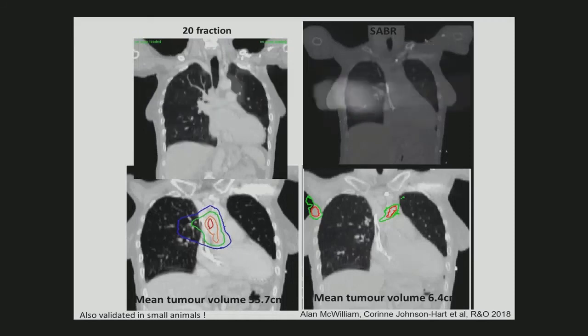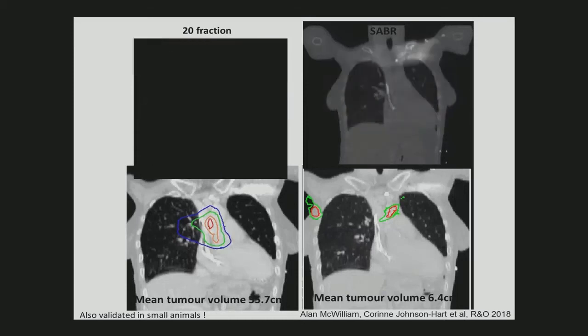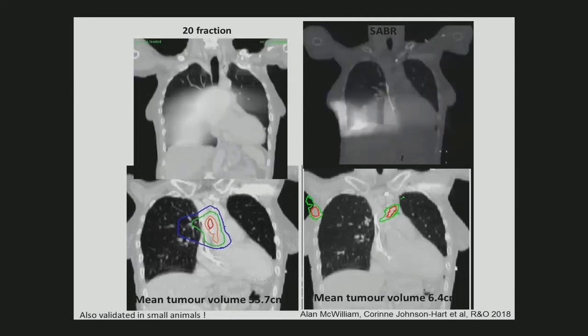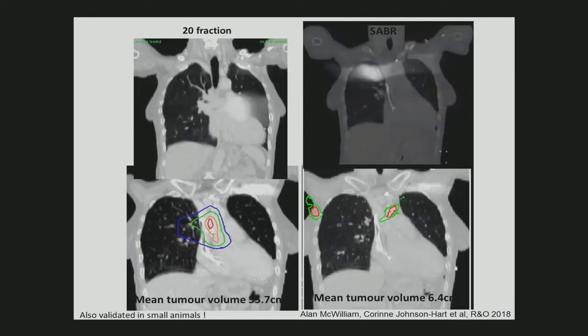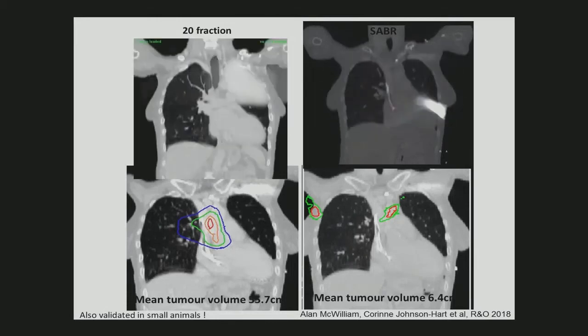Okay, so these are pictures of typical dose distributions that we were data mining. This is the significant region. This was validated in an independent cohort of patients that were treated differently. So these are patients with small lung tumors. So you see the dose is quite a bit smaller, and you find the same region, although you find an echo region somewhere else. And that's quite typical with data mining, because if you want to treat a tumor that is in a particular place, then you're always going to put the beams in a certain way. So we don't think this is real, but obviously we cannot exclude that it's real. We think this is like an echo of the significant region because of the way that these patients are treated, and so of inherent correlations of the data.